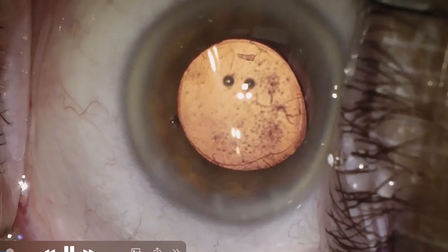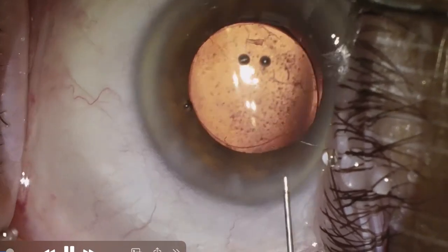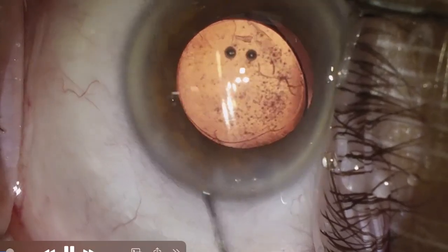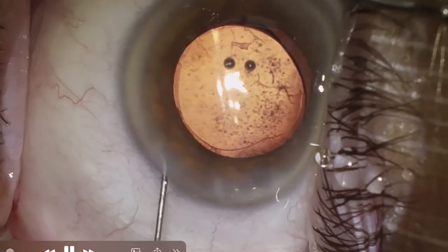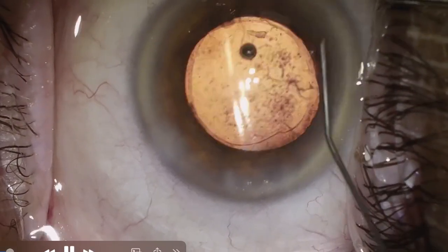Very good. Good capsular overlap of the optic here. We'll hydrate our wounds, and that looks really very nice. This patient went on to have a great outcome and did very well.